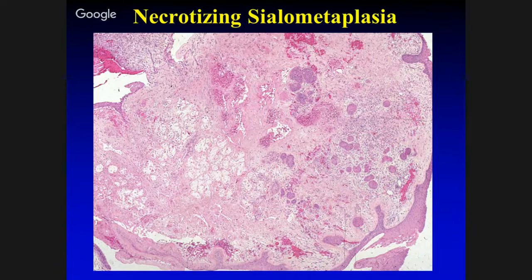So that's necrotic serous mucous glands. But the one thing you should pay attention to, and maybe this is not the best example, especially a little bit here, because this is the sialometaplastic areas, but there's a relative retention at low magnification of that lobular architecture that's normal for minor salivary glands.